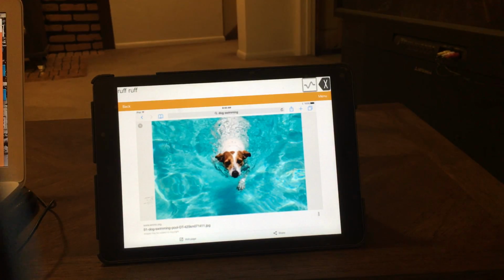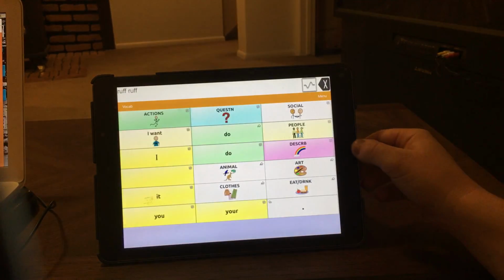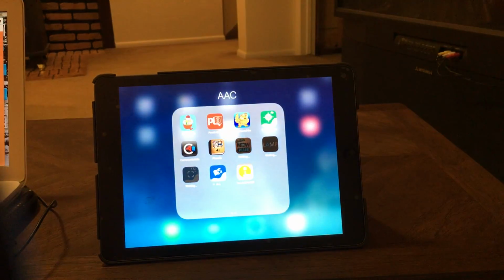Now this concludes our video demonstration of the TouchChat HD AAC iPad app. Thank you for your time.